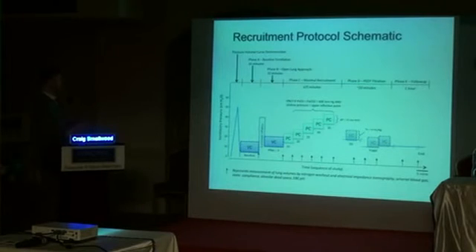So I said brave because the numbers that we're about to apply to these patients is frightening. But this is the time sequence of the entire study. It took about 4 or 5 hours in total. This slide looks pretty busy, but basically we got a PV curve here. That's what that little increase and decrease in pressure is. We did volume control as baseline or whatever the baseline was. We did a sustained inflation, and then we took EIT images.